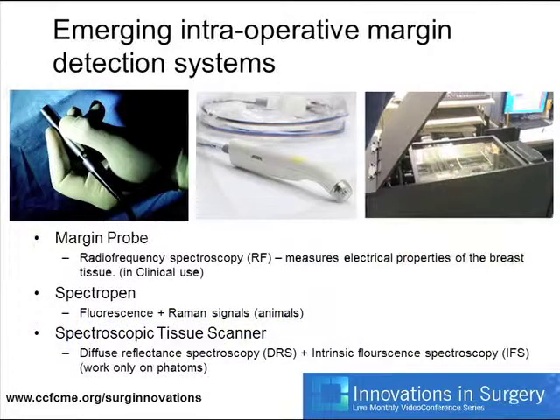Next slide, please. There have been a number of emerging technologies to try and help us change these things, and I think Beth Israel are on the call today, or at least I hope so, and I know some of the groups listening will have had experience of using these technologies. The margin probe has been around now for some time. I think it's been around since about 2004, and certainly it's got FDA approval.